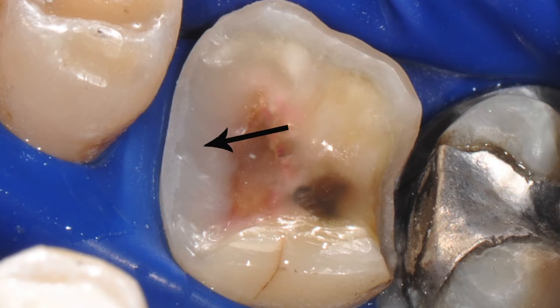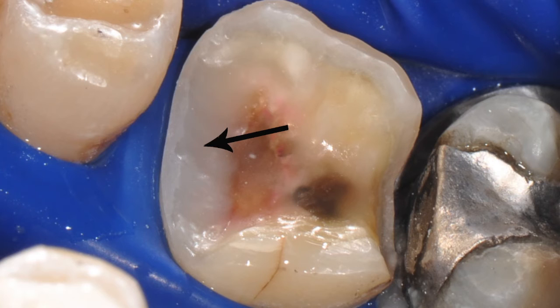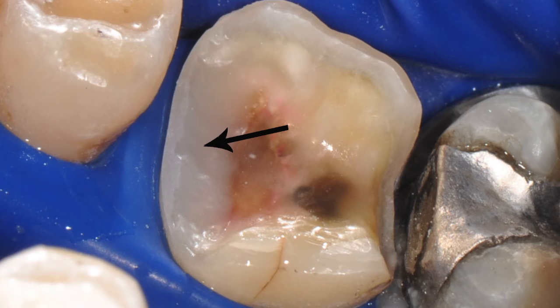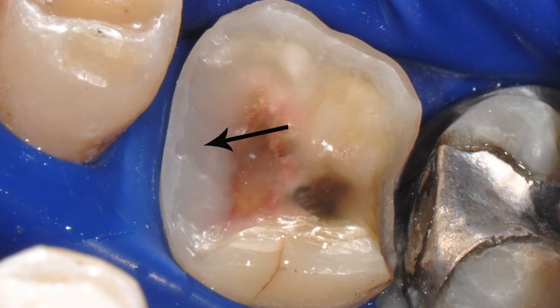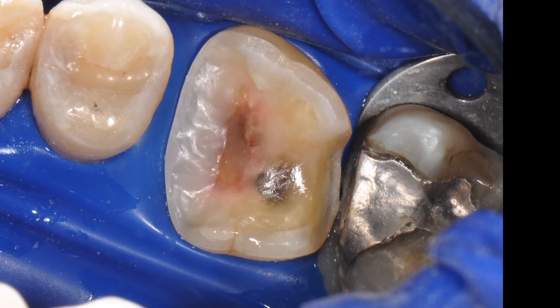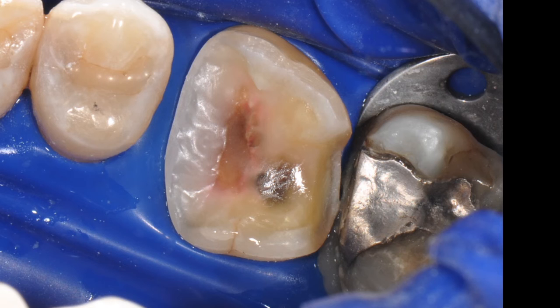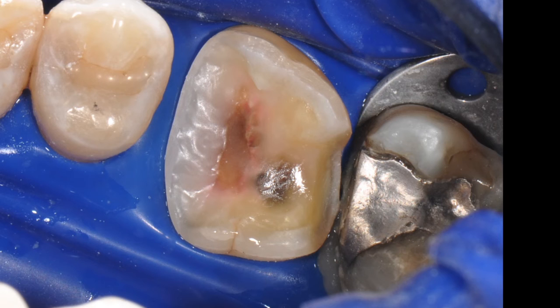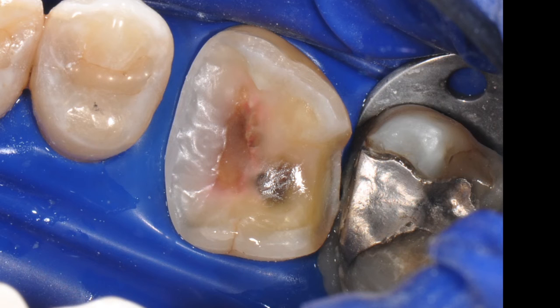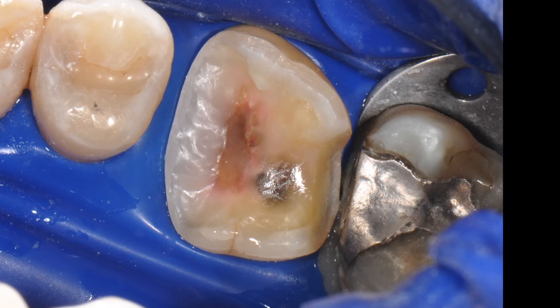Following sandblasting, a matrix band was adapted around the tooth and using meticulous bonding protocols a thin layer of composite was added to allow for a super-gingival finish line for our composite onlay. All dentin surfaces, including the residual decayed dentin, were sealed with bonding agent and covered with a thin layer of flowable composite. This step is referred to as immediate dentin sealing and is performed to create an established hybrid layer for an ideal bonding surface for the composite onlay.